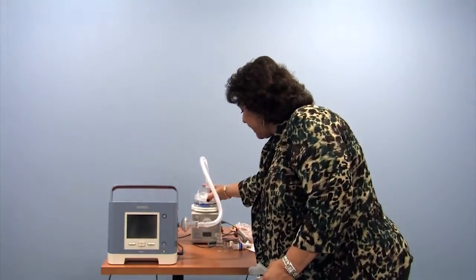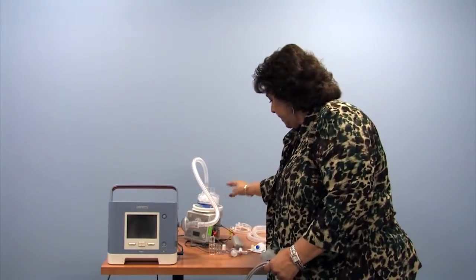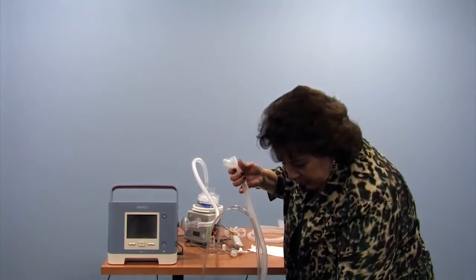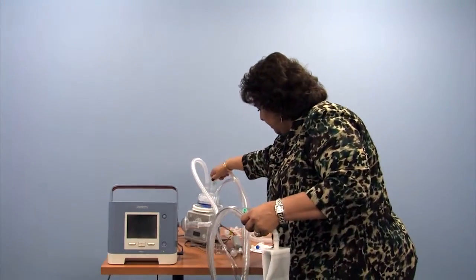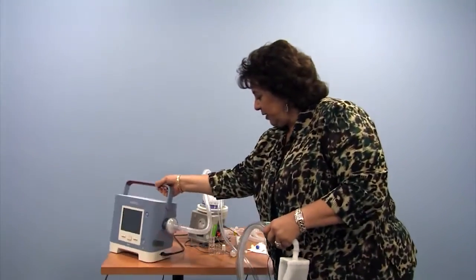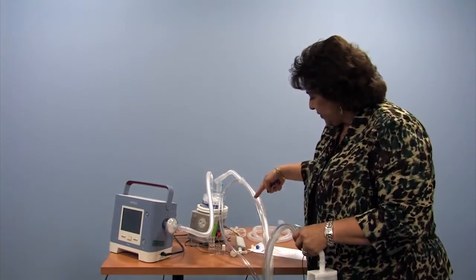But this will provide heated humidity, so the cold, dry gas comes out of here, passes over the warm water, which would be fed by a bag to keep it at a certain level, and then we would deliver the air to our patient. So with regard to the Trilogy active circuit with an exhalation valve, we have the main gas flow coming out of the machine, going through the humidifier and out the other side.